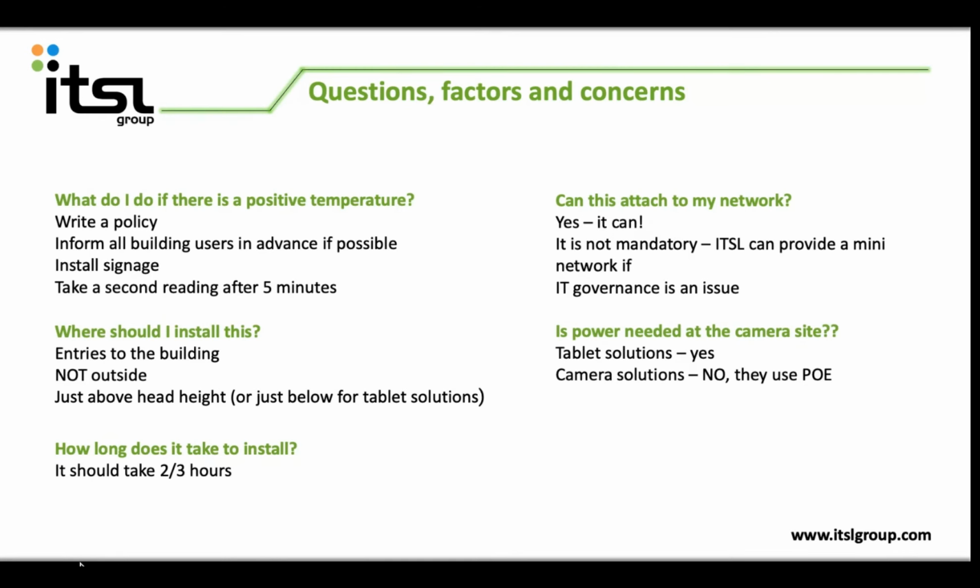I'll run on to the power piece. So is power needed at the camera sites? Tablet solutions, yes, but we don't see that as a problem as often. It's going to be sited on a turnstile or on a reception desk where there's going to be power available anyway. When the tablet is mounted on a floor stand, all the cables exit nicely at the bottom, so they can run off to the closest wall outlet or a floor box if you have those.